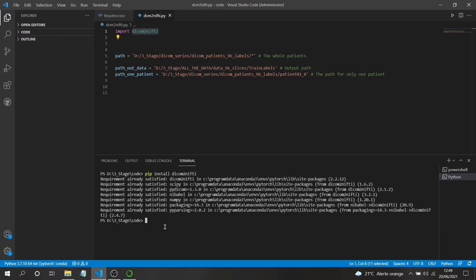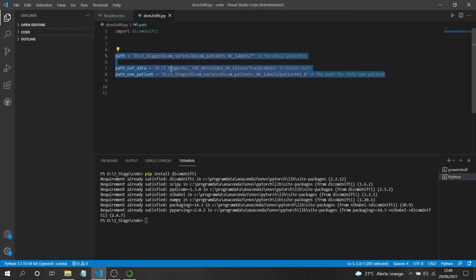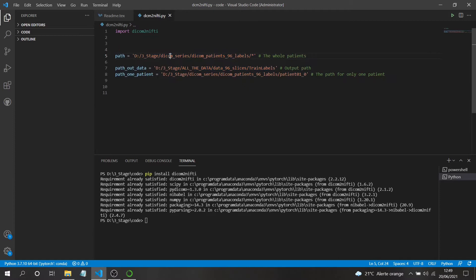After installation, we'll need only one line of code. I've imported three path variables: one for all patients, one for the output, and one for a single patient. We'll start with the single patient case and then move on to converting all patients.